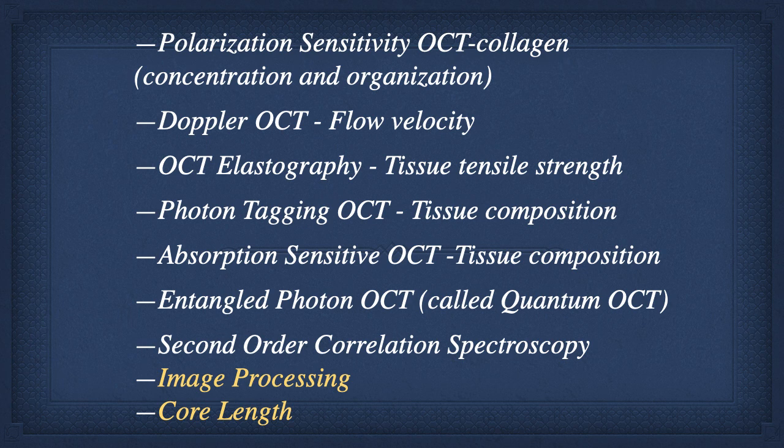And that paper describes why we thought that given time. So long cores, more than 5 millimeters, we see them 30 millimeters long, associated with the TCFA, is more likely to lead in our assessment to acute coronary syndromes.